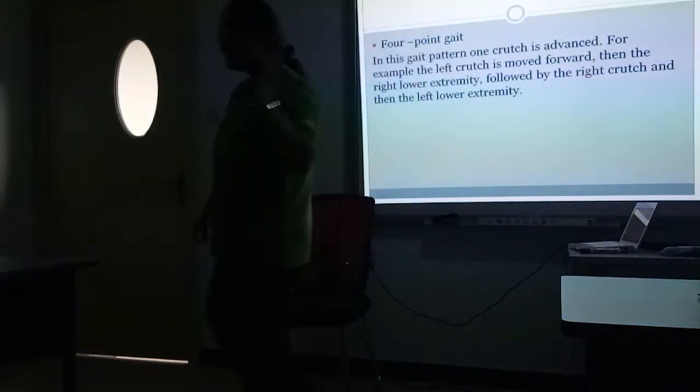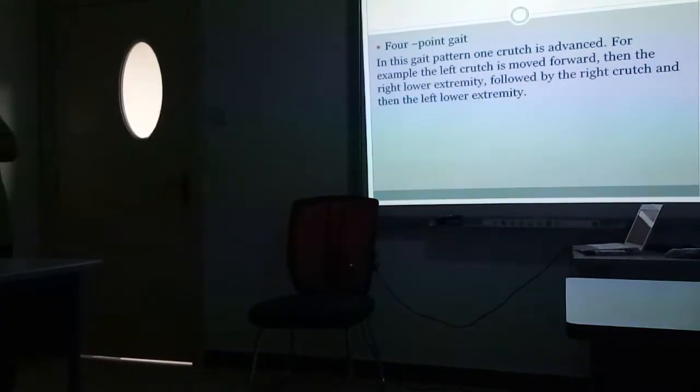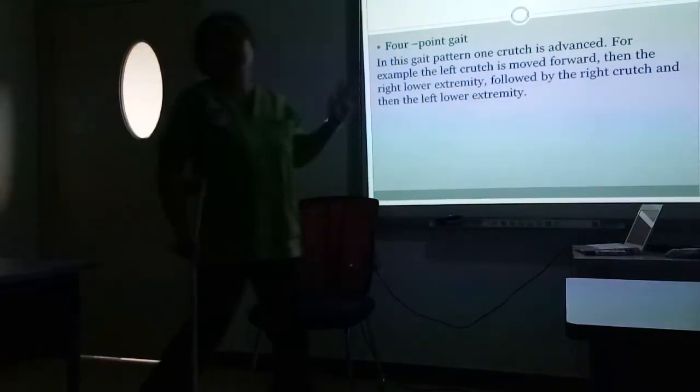4-point gait. Ito parehas sa 2-point gait, kaya lang ito ay slow. Pag ano nito, hindi siya sabay nito. Okay?